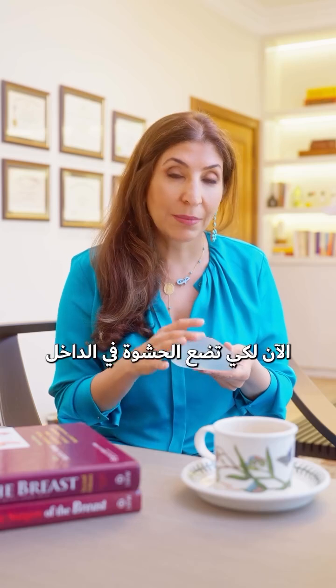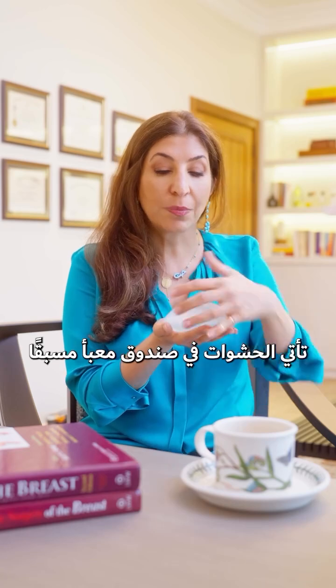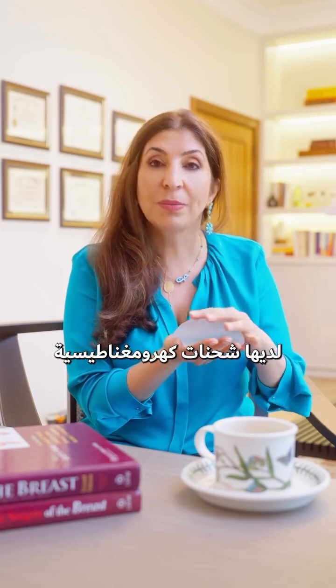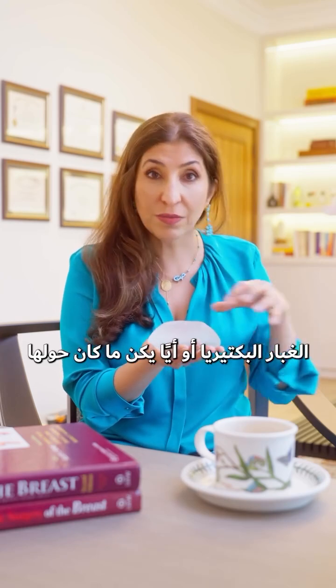Now, to place the implant in, there are 2 things that are very important. The implants come in a pre-packaged box. And the implants within this box have an electromagnetic charge. So if you open the box, immediately it attracts dust, bacteria, whatever is around it, to the implant. So what we often do is, while the implant is still in its box, we inject some antibiotic solution into it to coat the implant, and then we open the box, and that prevents bacterial contamination around the implant.